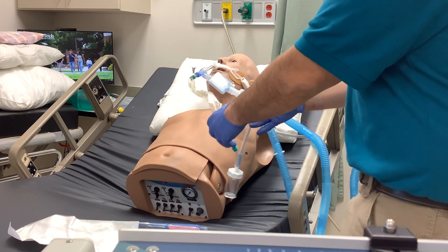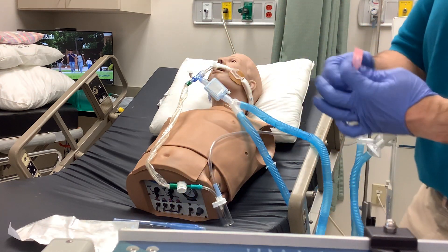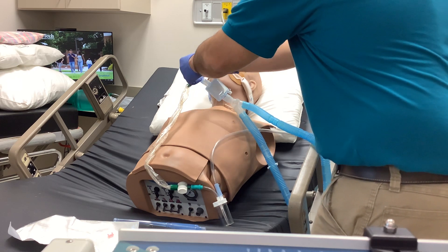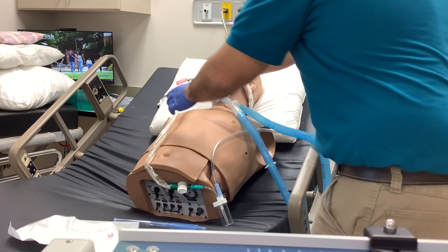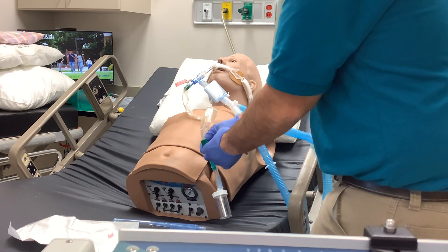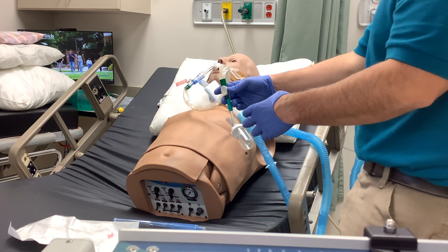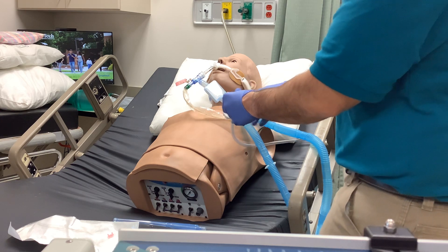Now when you're ready to go in and do your suction pass, after your patient has been hyperoxygenated, you can proceed. If you're going to utilize a saline bullet, you can place it in your lavage port. Before you make your suction pass, make sure that your catheter is in the unlocked position. You also want to make sure that the Lukens trap stays in the upright position as best you can, because if you get a nice sample, you wouldn't want it to get sucked back up through the vacuum tube — there's no one-way valve to prevent that from happening.